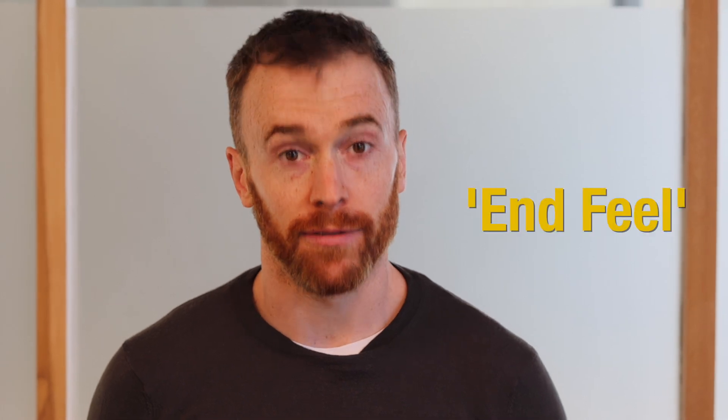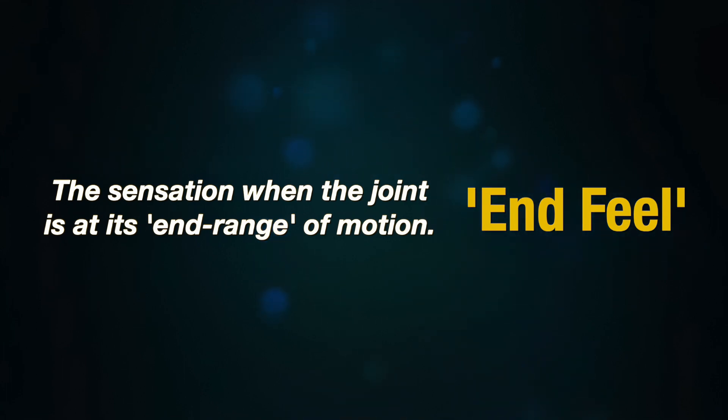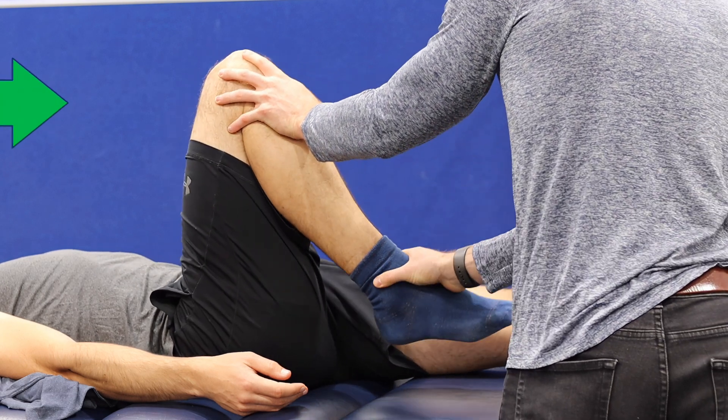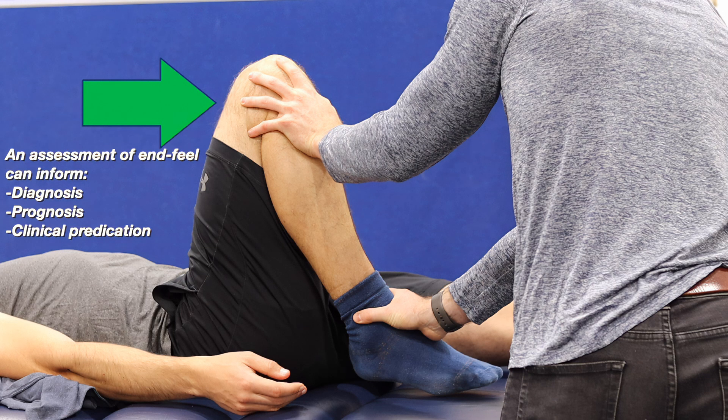The end of each motion at each joint is limited from further movement by particular anatomical structures. The type of structure that limits the joint has a characteristic feel which may be detected by the therapist performing passive range of motion assessment. This feeling — experienced by the therapist as resistance or a barrier to further motion — is called end feel. An appropriate assessment of end feel can support the examiner in assessing pathology, identifying the limiting structures to motion at a joint which could inform treatment, and to determine prognosis or the severity of a pathology.